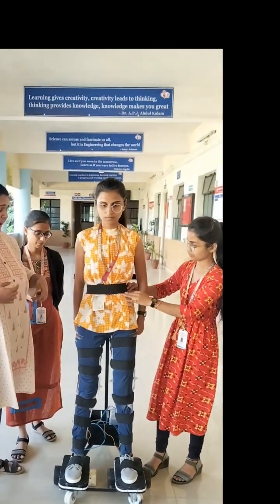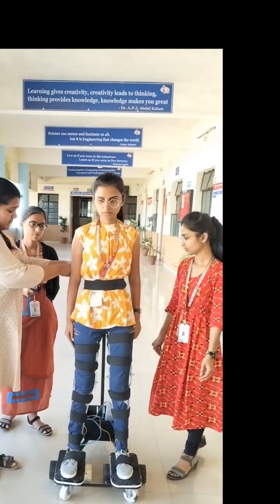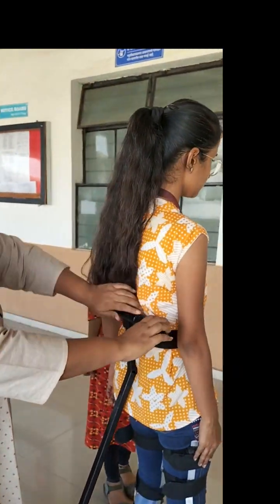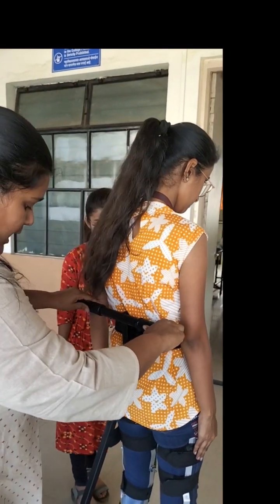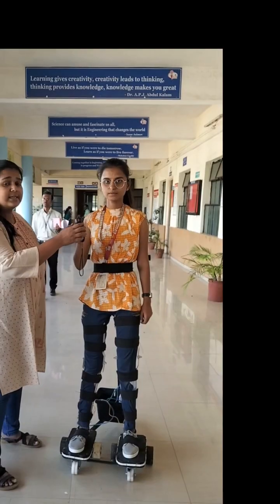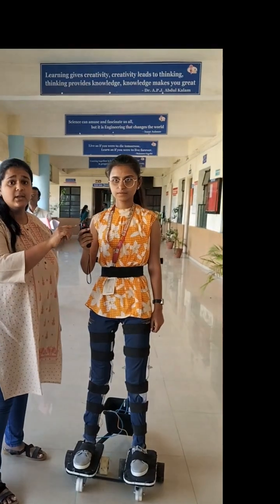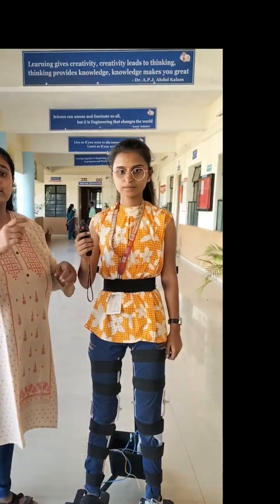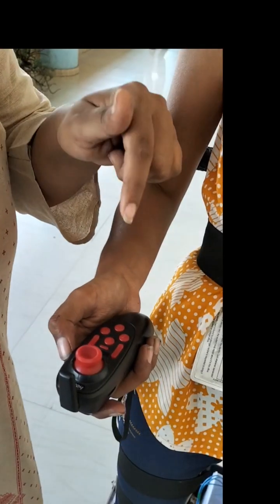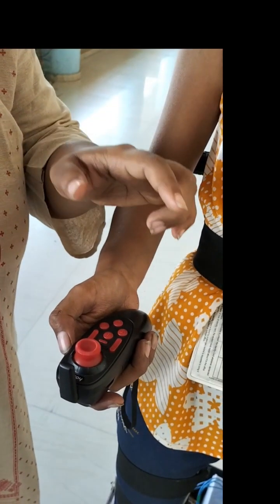The person can walk in a backward posture, and here is the back support provided for the flexibility of the person. He can walk efficiently with the back support. This is an RC transmitter joystick which is used to connect the controller with the circuit. By using this RC transmitter we can control the speed of the system.